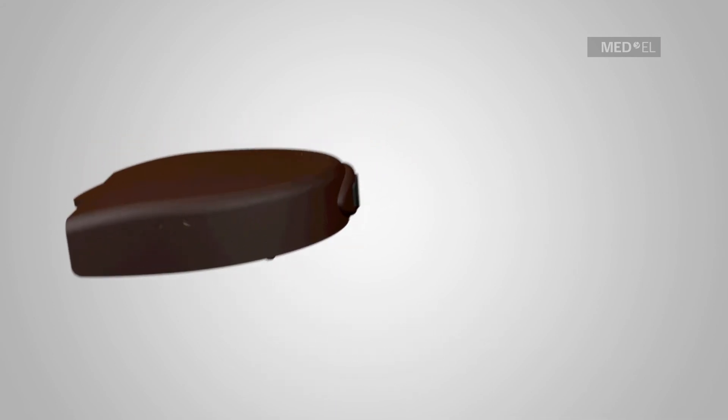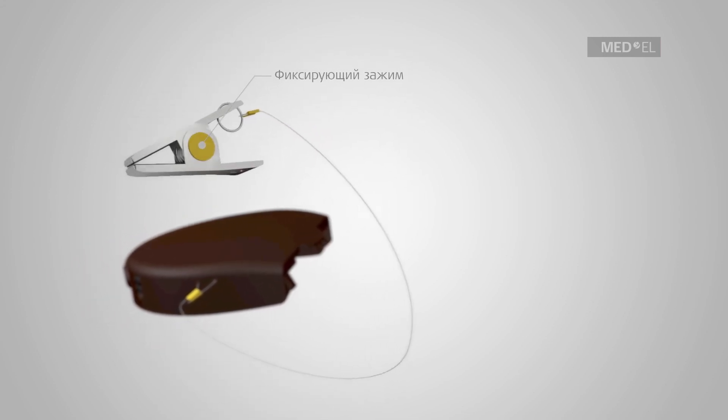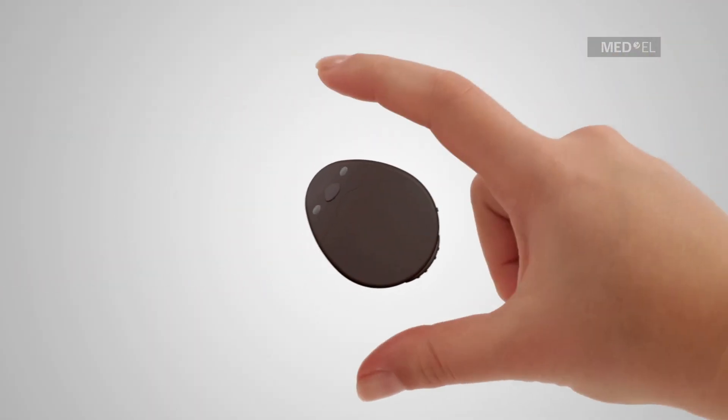Attachment holes are positioned on either side of the battery pack. A line attached to the clip may be threaded here.